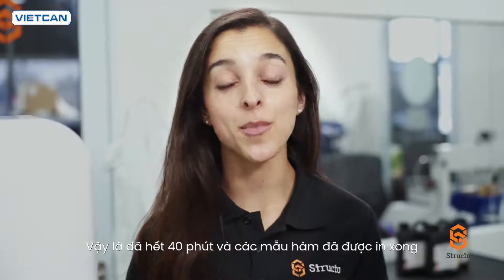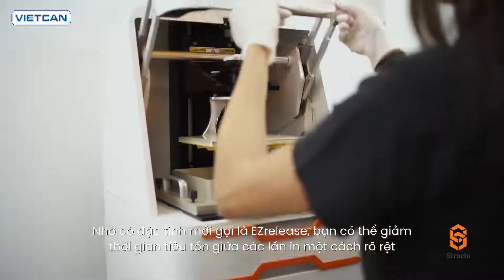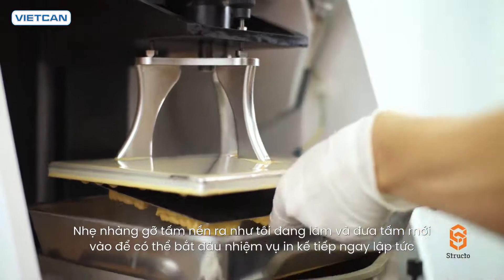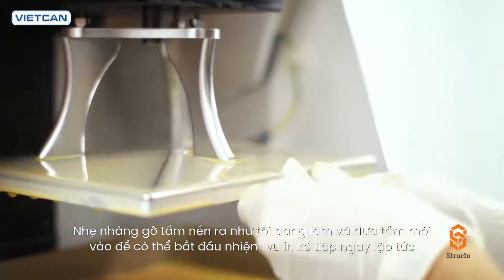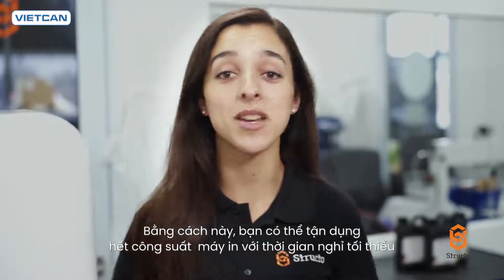It's been 40 minutes and the models are now ready. Thanks to a new feature called Easy Release, you can now significantly reduce the time spent in between print jobs. Simply remove the platform of models like so, and pop in a new shiny one so that you can immediately start your next print job. This way, you can fully utilize your printer's capacity with minimal downtime.